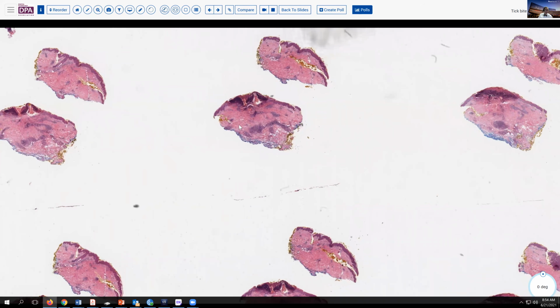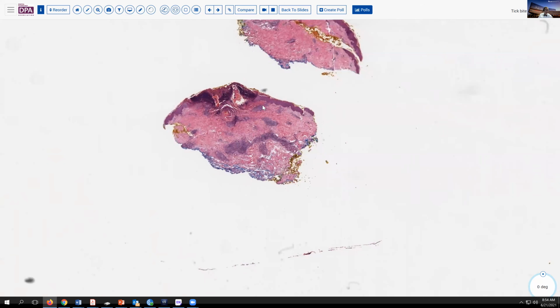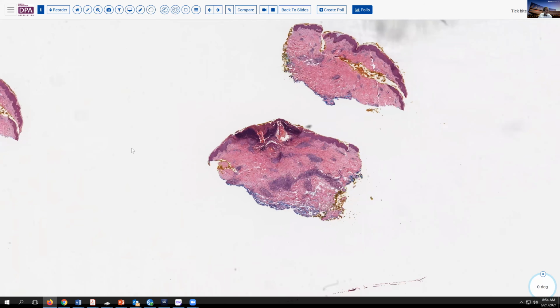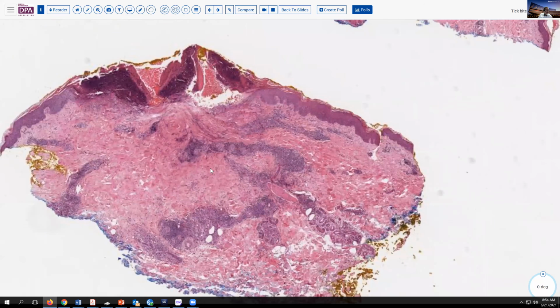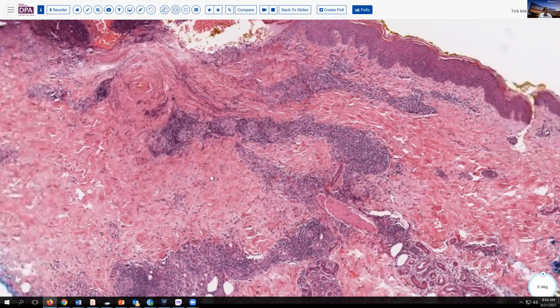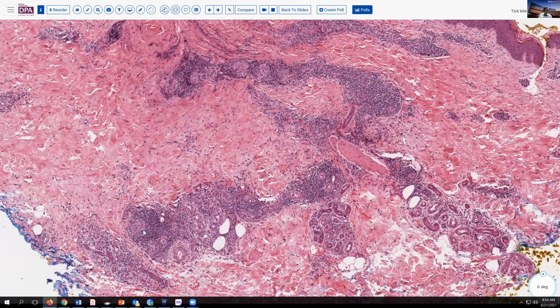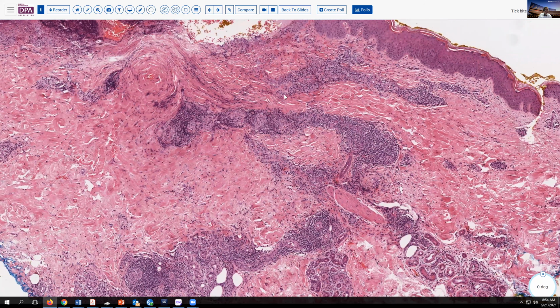As you can see here, we have an infiltrate that is both involving the superficial vessels and very prominent quite deeply, as well as this little crater here where the mouth parts of the tick were inserted. So we'll take a look here at this particular cut. And as we might expect, this inflammatory infiltrate involves the perivascular structures. Here you see rather tight process, and it's got a fair number of chronic inflammatory cells in it.